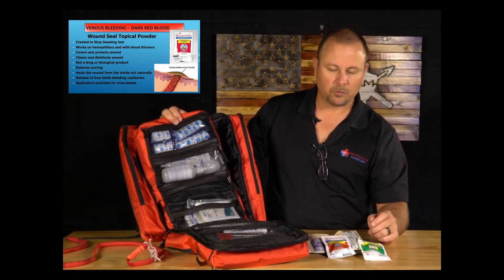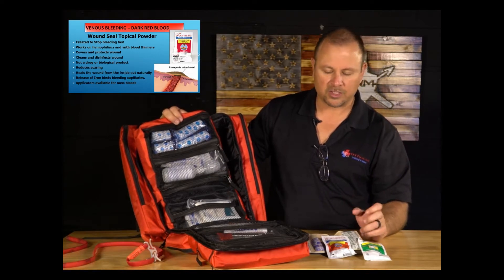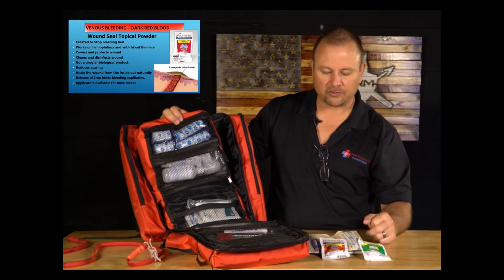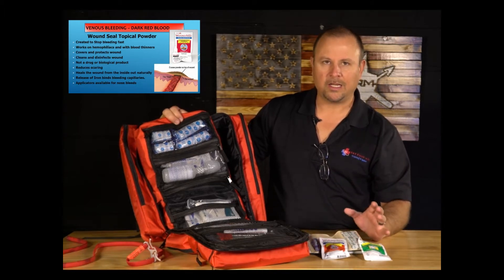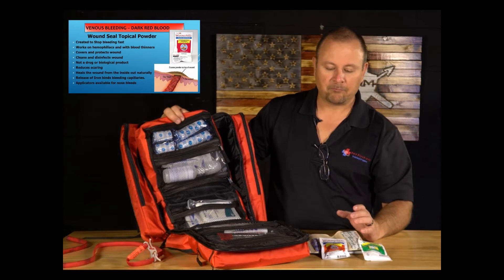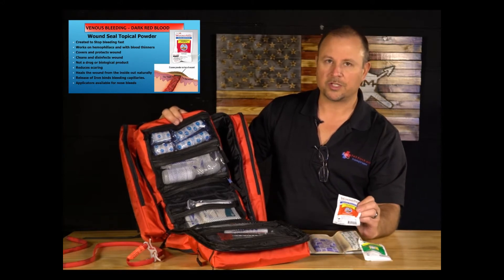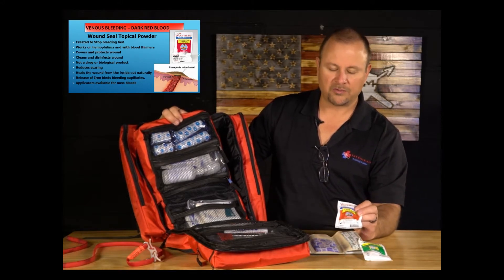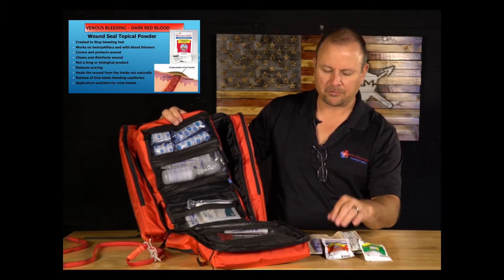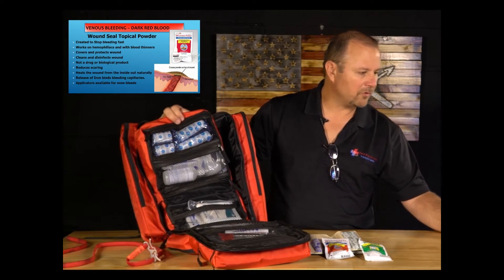Wound seal covers and protects the wound and creates a scab that's more pliable than a regular scab — it has some flex, so it doesn't crack open. You can use it on anything where a tendon or ligament hasn't been lacerated; even then, if you need to control bleeding, it's fine, though it won't repair the tendon. It heals with 70% less scar tissue than stitches and is now being used in open heart surgeries.